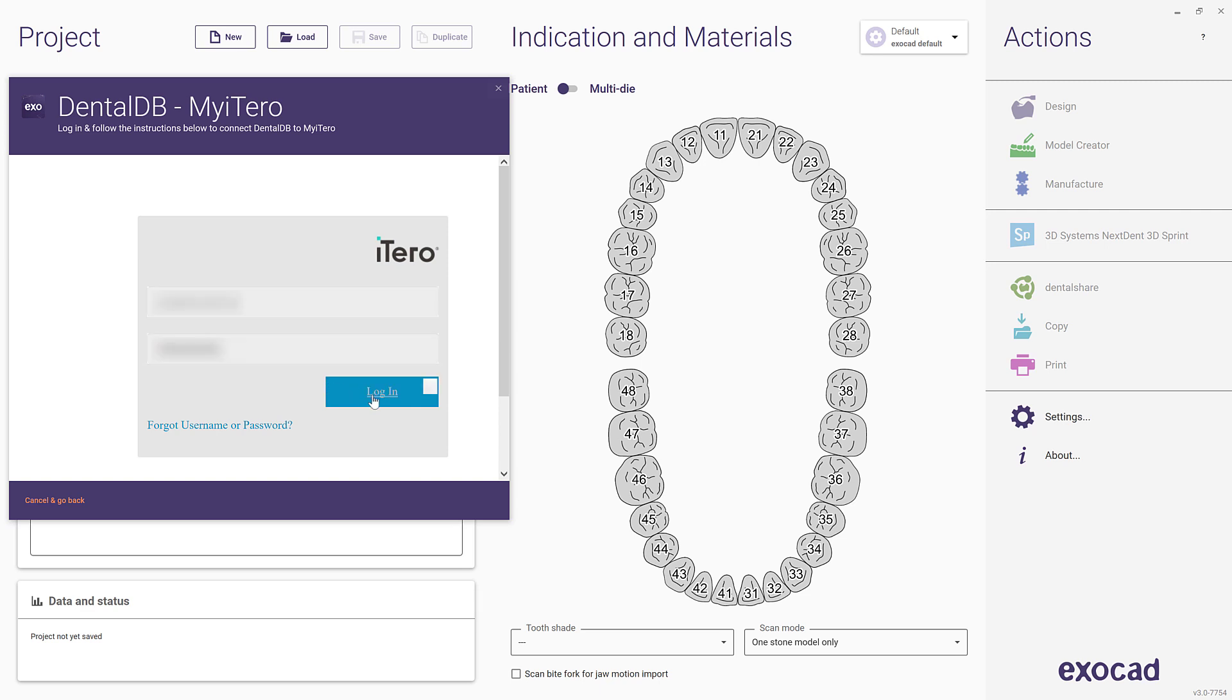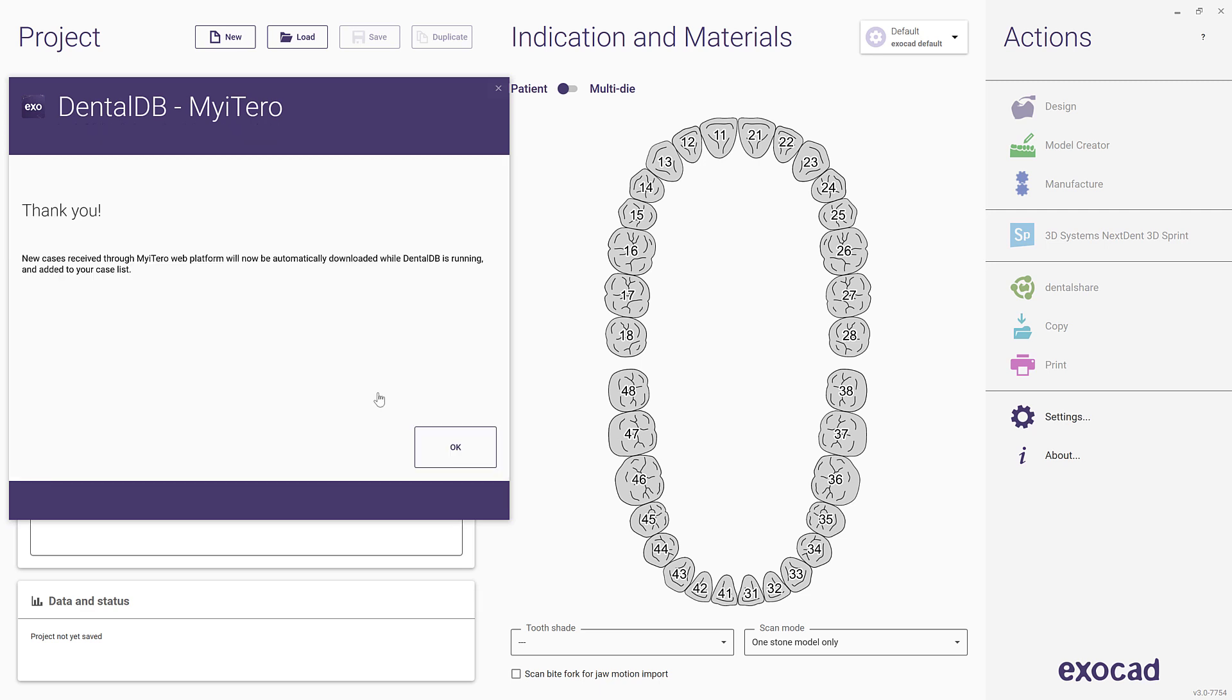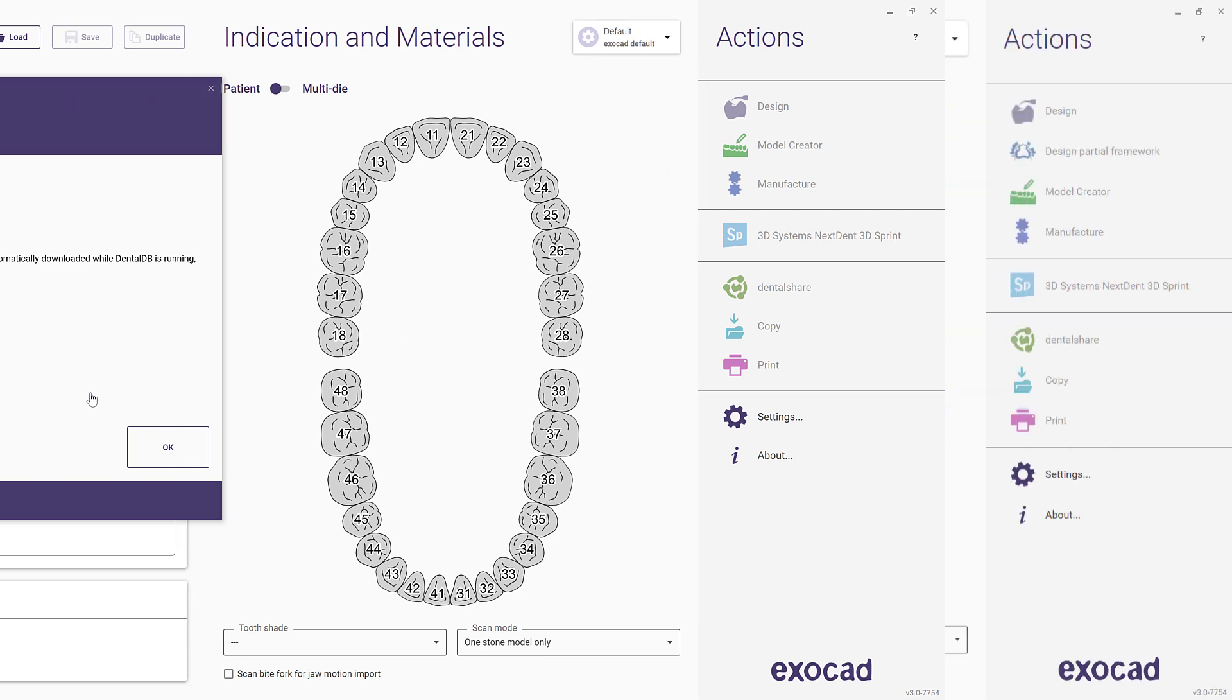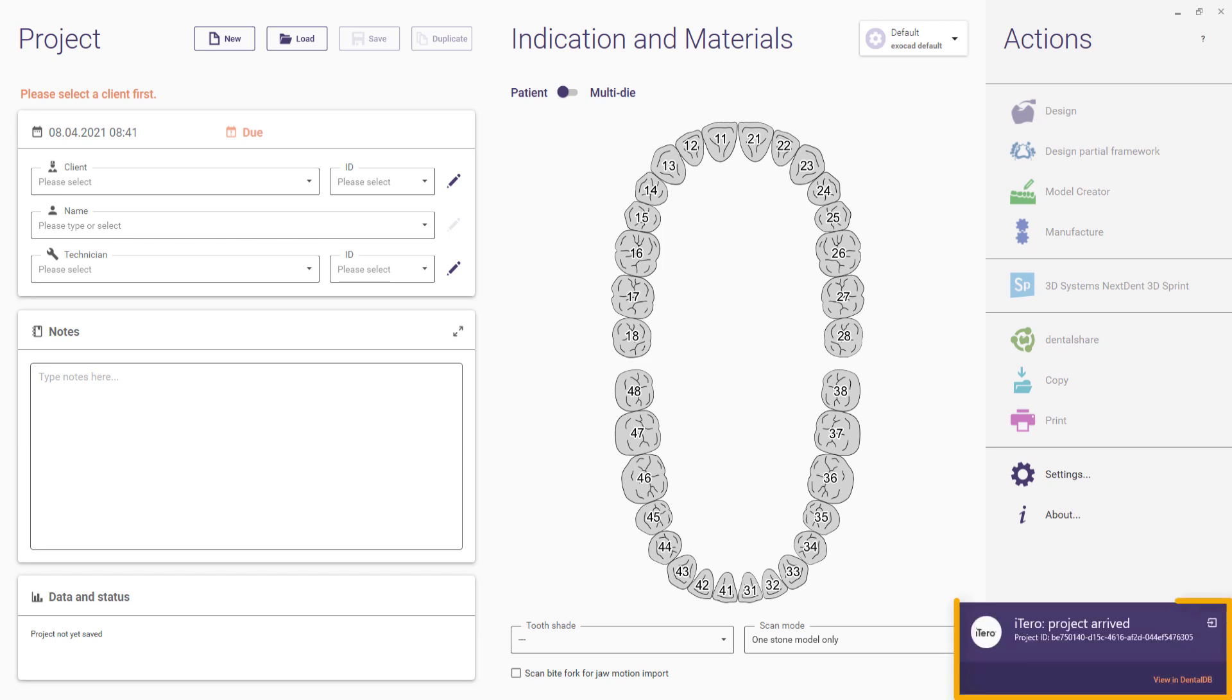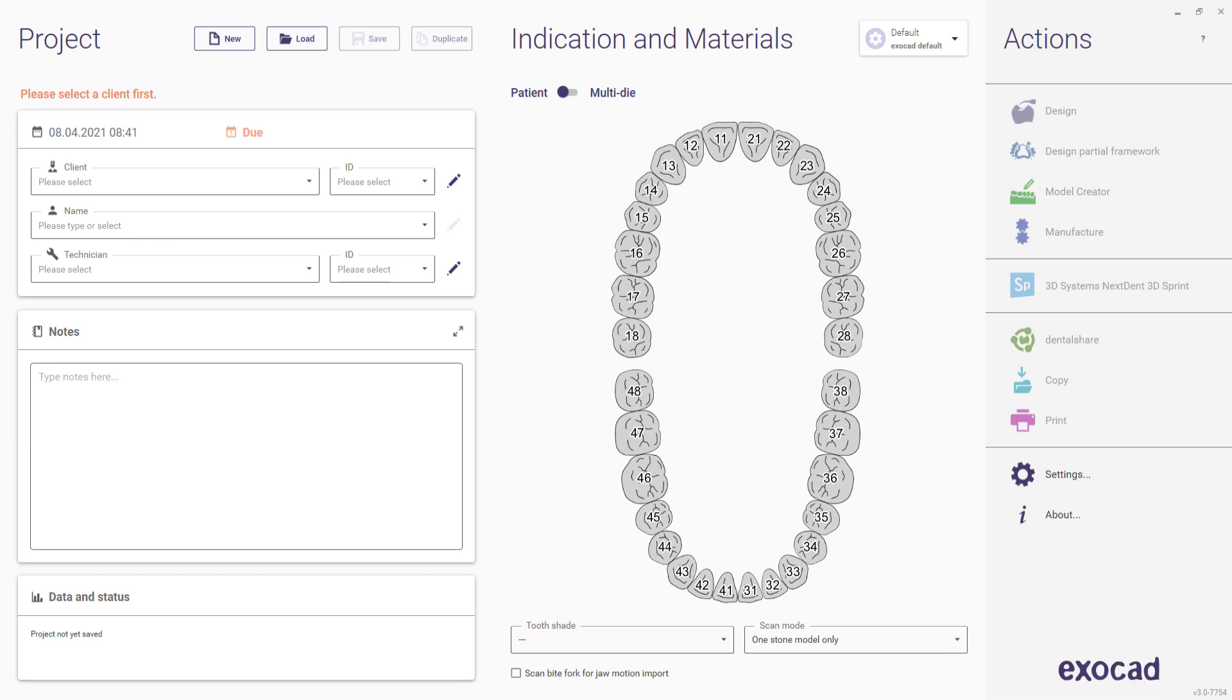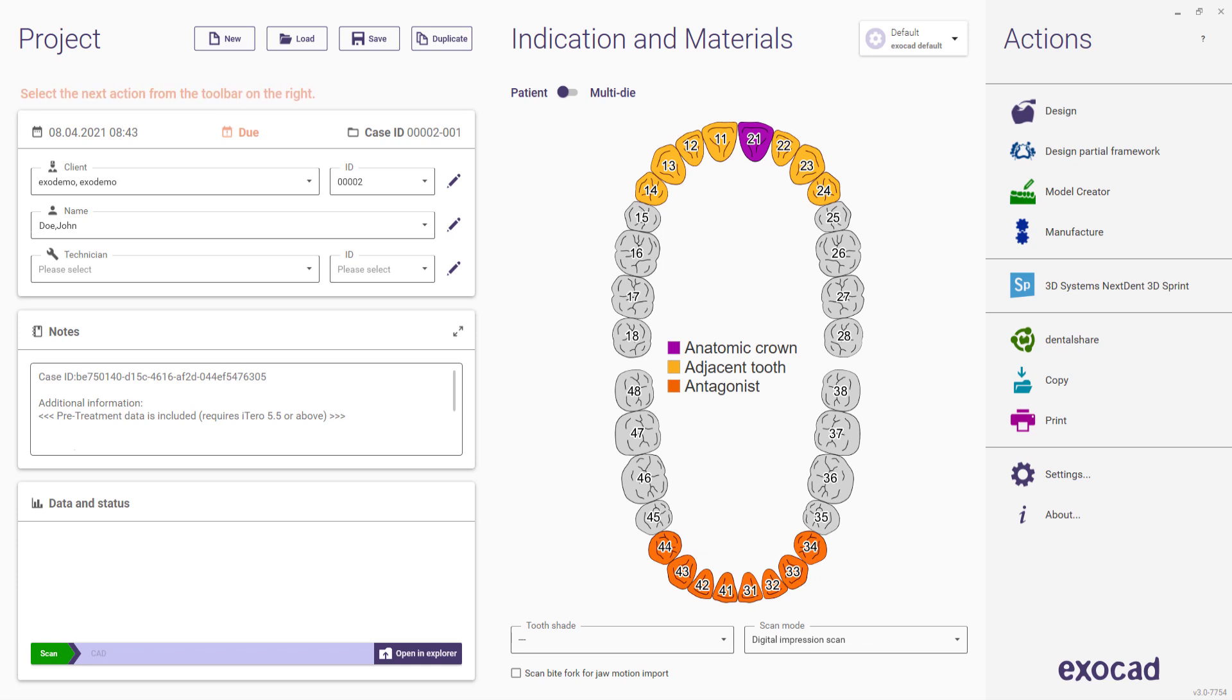Please note, in order to access My iTero, you need a My iTero account. For further information about setting up a My iTero account, please visit the Global iTero website. Once your ExoCAD installation is connected to My iTero, newly received cases will automatically show up in your DentalDB case list with all the data.